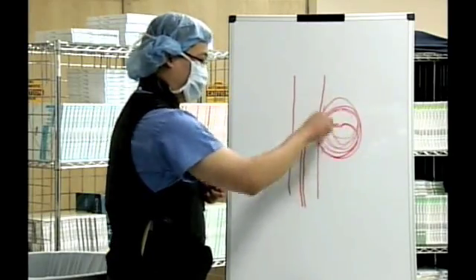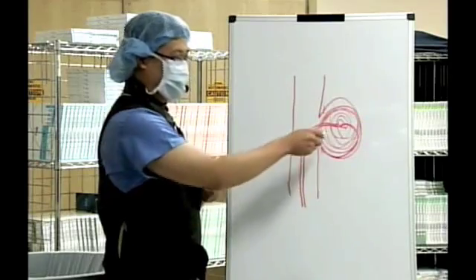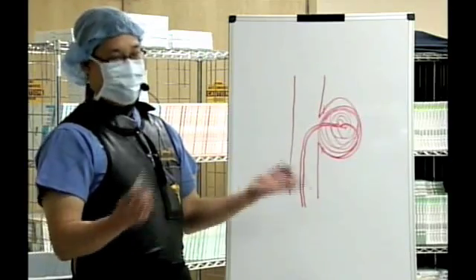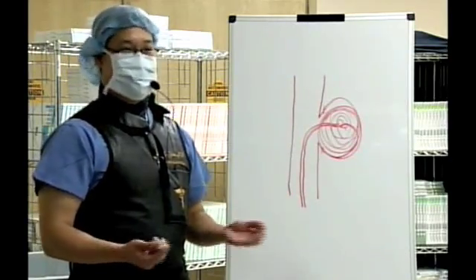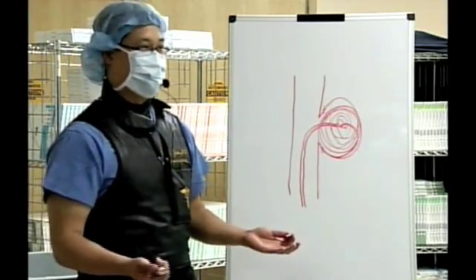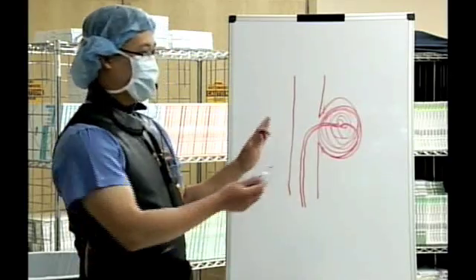The idea is to fill the inside of it so much that no blood goes in, and so then it can't rupture. So, if there's no blood going into it, you're not going to have a problem. And so that's what we mean when we say we're coiling an aneurysm. But that's the basic idea.